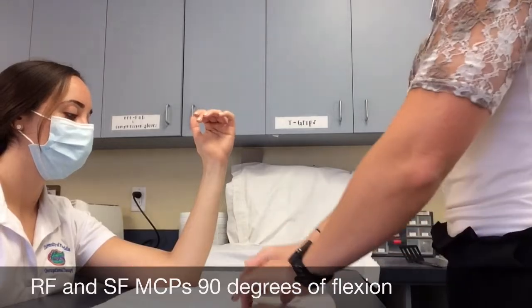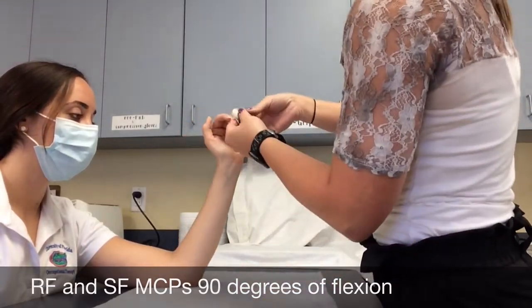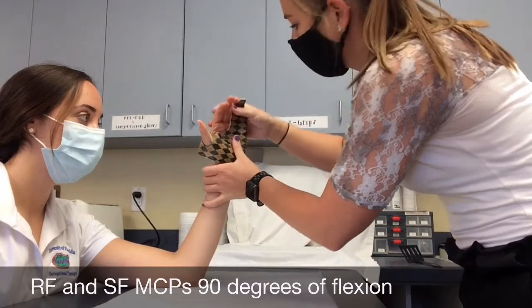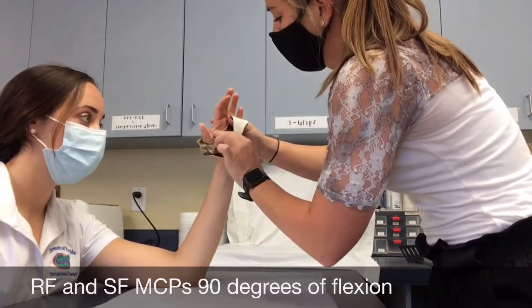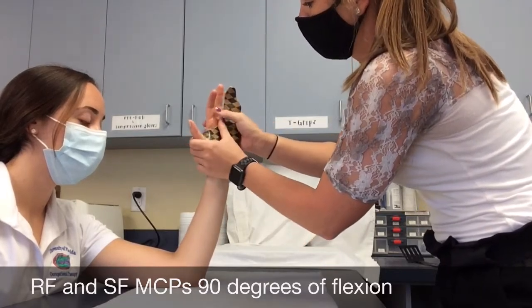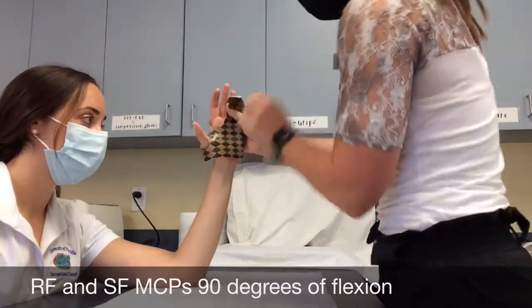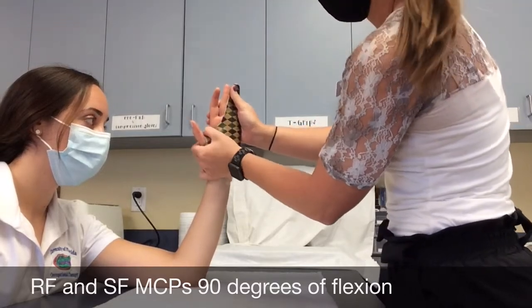After you pull the thermoplastic out of the water, have your patient in a relaxed position in slight wrist extension. First, place the patient's thumb through the thumb hole to make sure that it fits correctly, then you can roll the edges of the thumb for comfort. After ensuring that the thumb fits properly, you can then start to mold the patient's hand, while also making sure the ring finger and the small finger are as close to 90 degrees of MP flexion as possible.